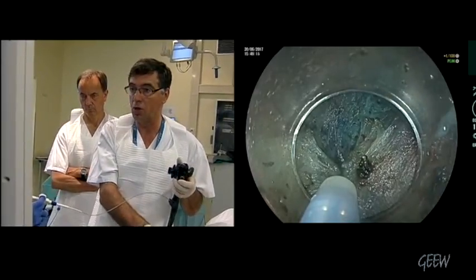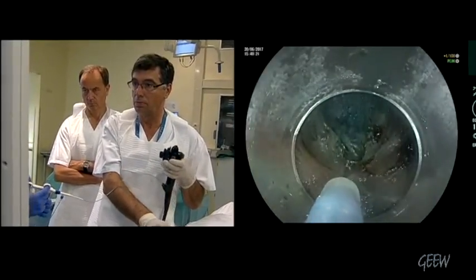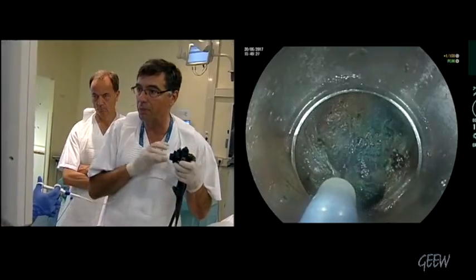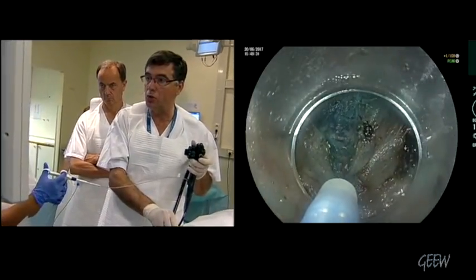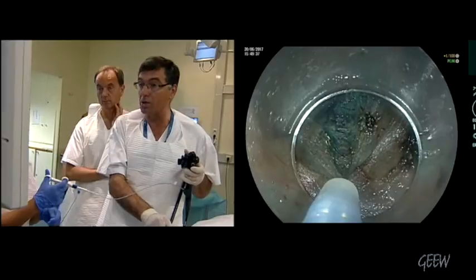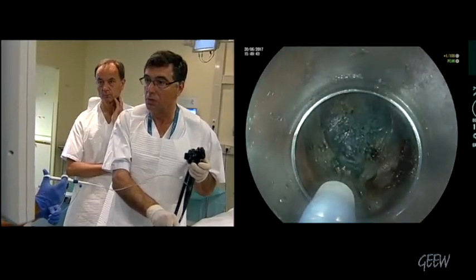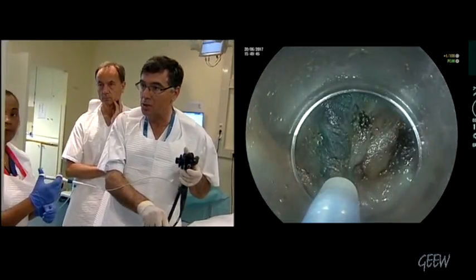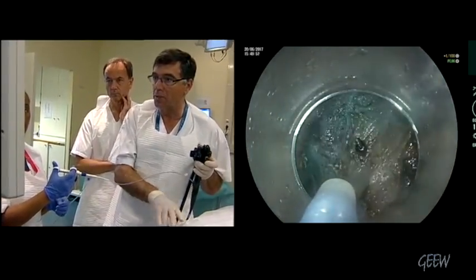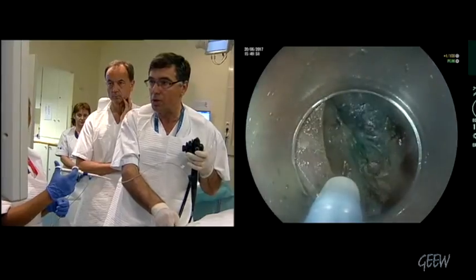It's better to do the myotomy and pylorotomy in a retrograde fashion. So I pull back. We already completed the pylorotomy. Now what I do usually is to extend over two centimeters on the muscle layer in the stomach, in retrograde fashion. I take care not to do any serosa injury or perforation.